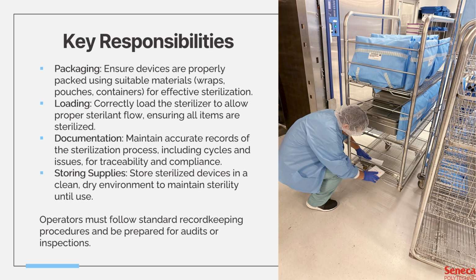If rigid containers are still too hot to the touch, operating or using them is too dangerous for you. Why would you try touching it, right? Like why would you even put it away when it's still warm, when it's still too hot? So it's just better to be on the safe side and wait the proper amount of time for it to completely cool down.